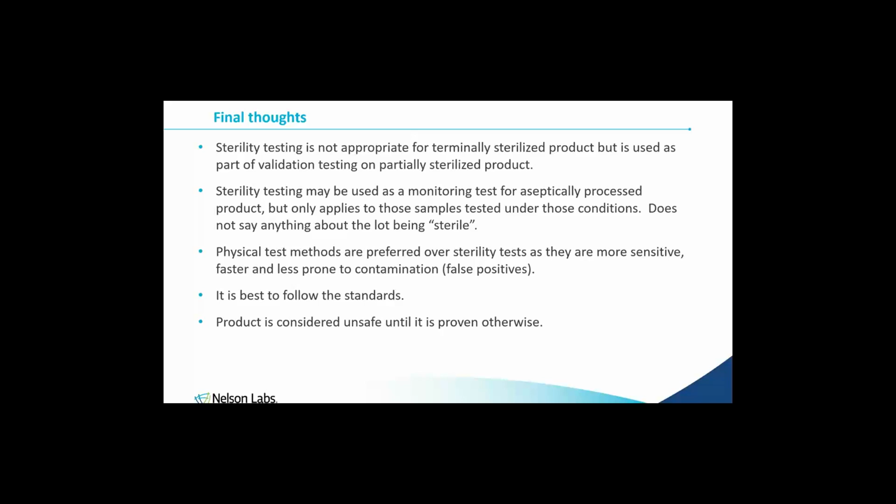And this is really what things come down to at the end of the day. We're ensuring patient safety. And when it comes to patient safety, your product is guilty until proven innocent. It's unsafe until it's shown to be safe. You have to have the data showing it's safe and acceptable so that it's safe for a patient.